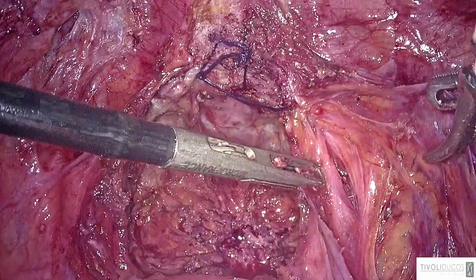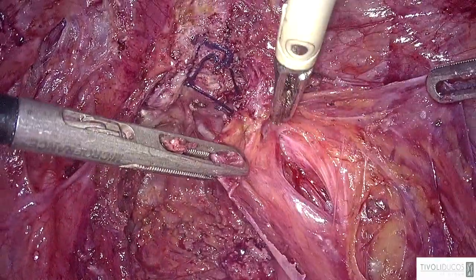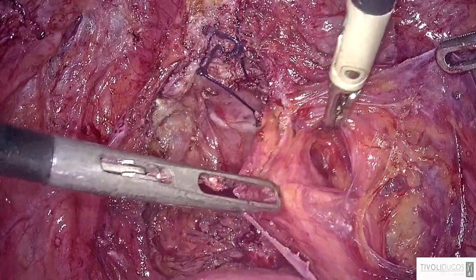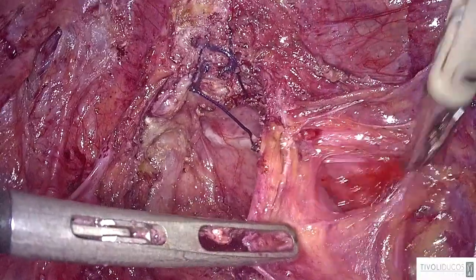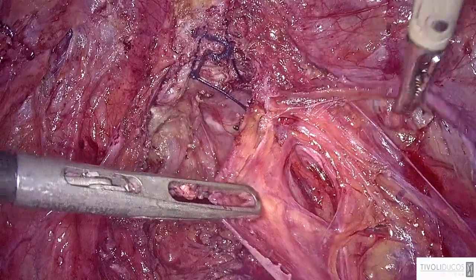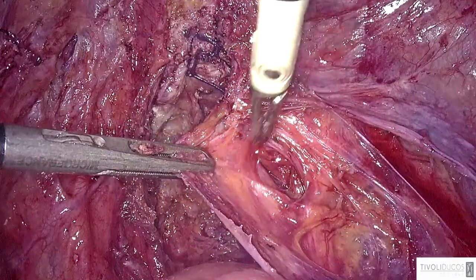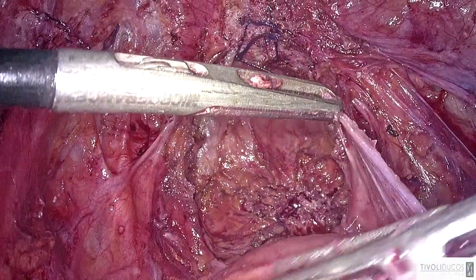And if you remove a parametrium down to sacral roots, I think you have to be very, very cautious on the other side. So here, as you see, the nodule is here, it goes down. So I will separate the uterosacral ligament from all the nerves located at the exterior, meaning that I won't go below the ureter, because first I don't need to. Here it is completely safe. And I will cut here, I will pull the endometriosis here, and I will try to clean all the normal tissue and to remove only the involved tissue.